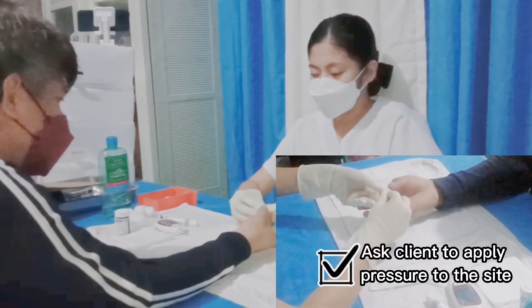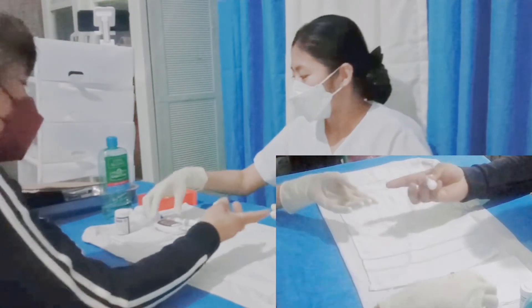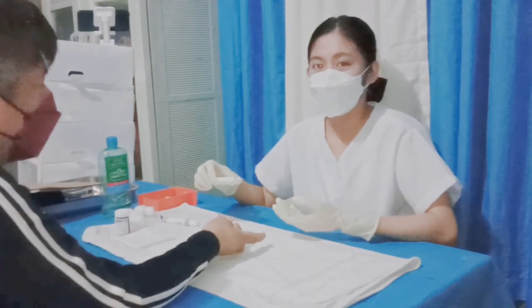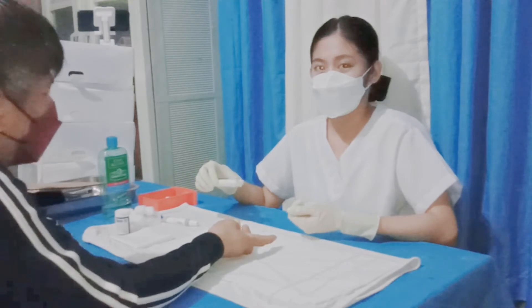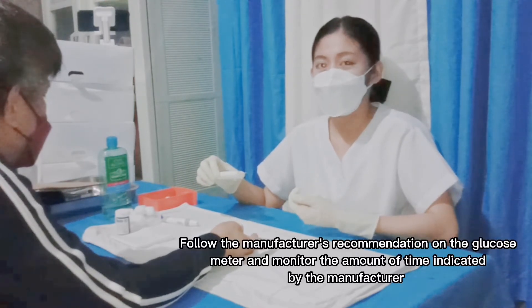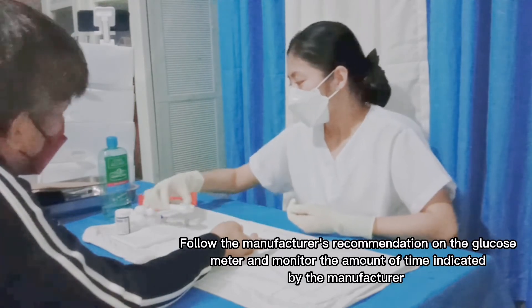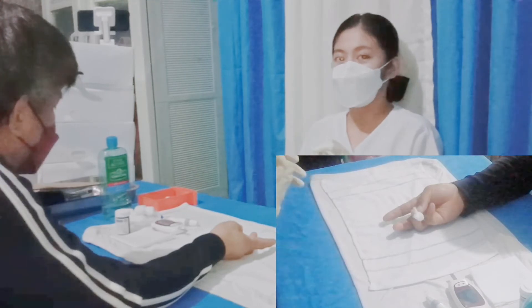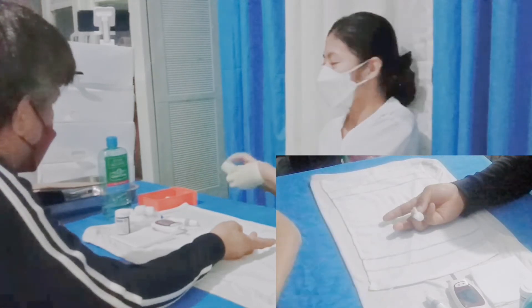So kindly put pressure to the site. Now we are going to wait until the meter is done reading the results. Make sure to follow the specific instructions depending on the manufacturer. After obtaining the results, we are now going to document the data in the client's record.